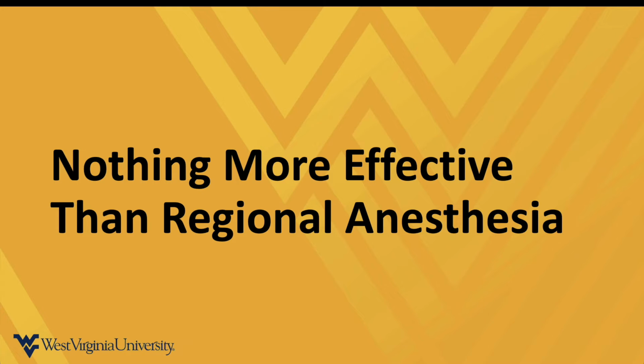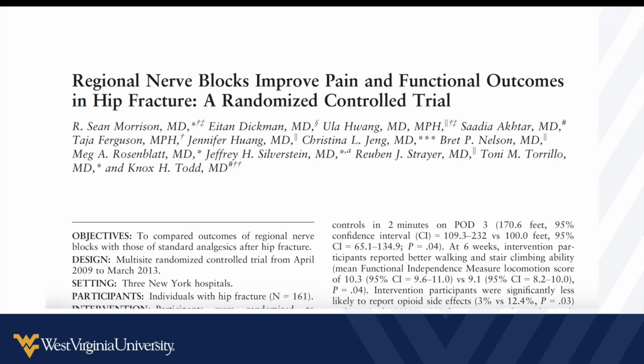Depending on the scenario and the injury or the pattern of the process, regional anesthesia may not be complete. It may not make the area of injury or concern completely insensate, but it's going to decrease the need for other analgesic modalities. And in some scenarios, you may be able to take their pain from like 50 to 0 right away. There's a significant literature base for many of these things that we're going to talk about.